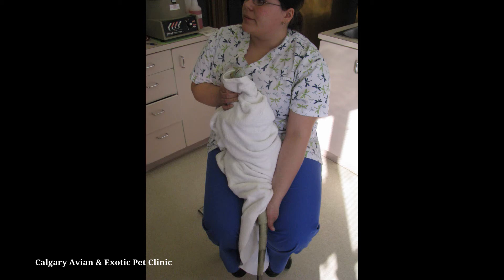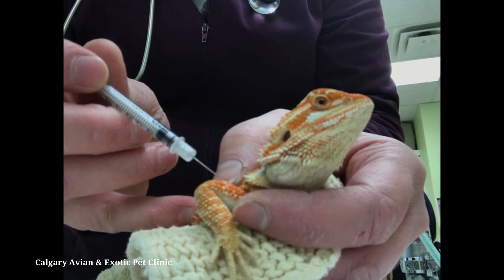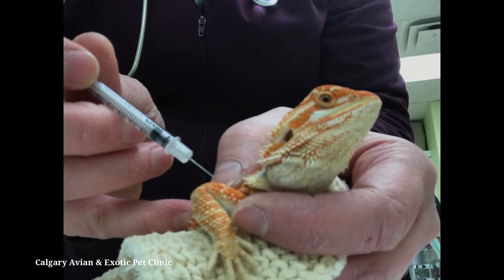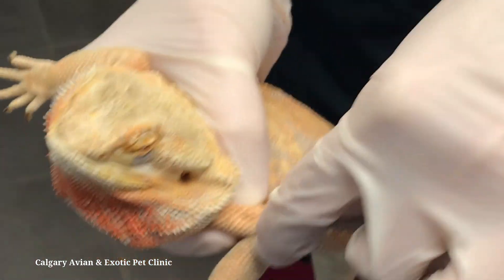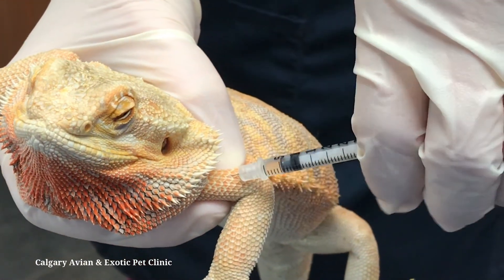Give the injection in muscles in the front limb between the elbow and shoulder by inserting the needle between the scales at a 45 degree angle, aiming for the middle of the muscle. Once your needle has been inserted into the muscle, draw back slightly on the plunger to ensure that you have not entered a blood vessel.